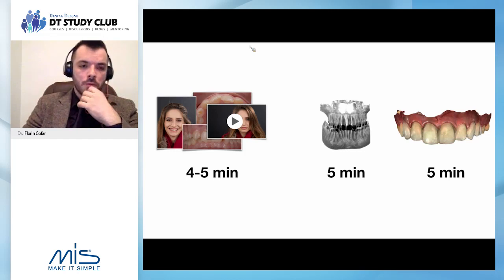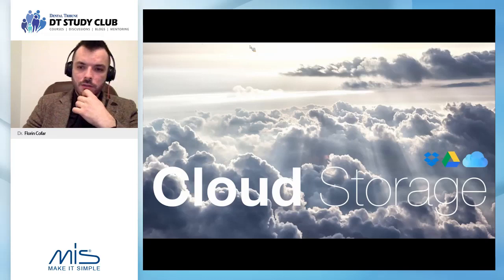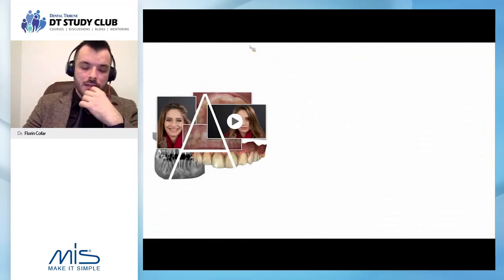Regardless of how you want to work, you will always need these things. We're talking about CBCT and STL and photo-video records. Now, one of the benefits is obviously once you have this, cloud is no longer an issue today. You can store it very easily. We can have patients available to us on any device.